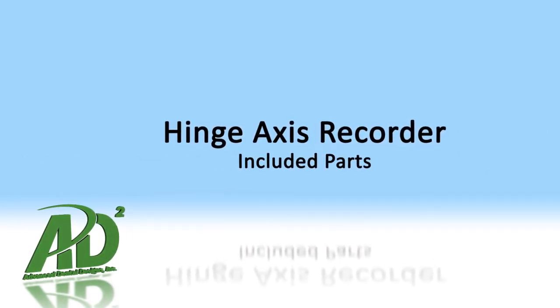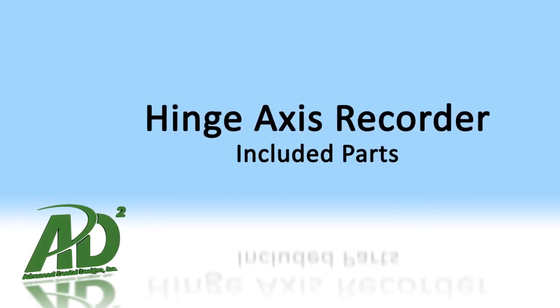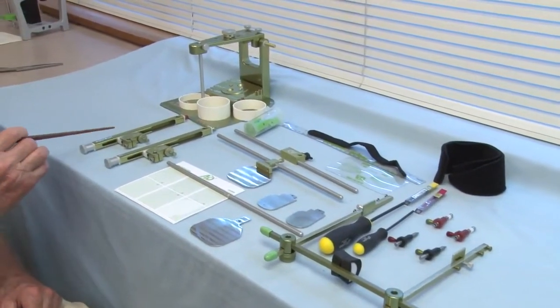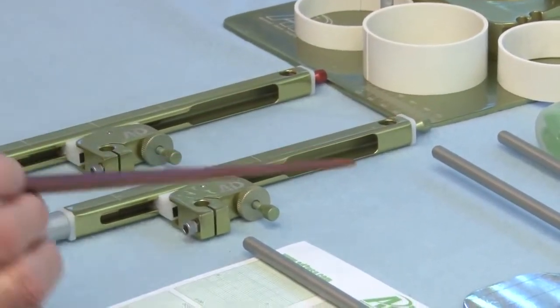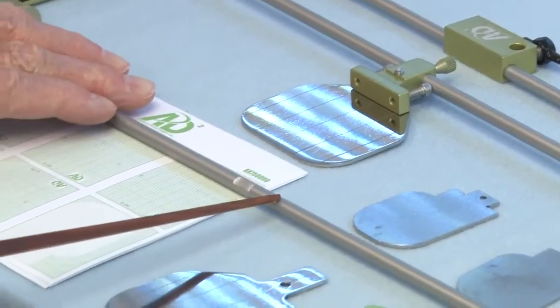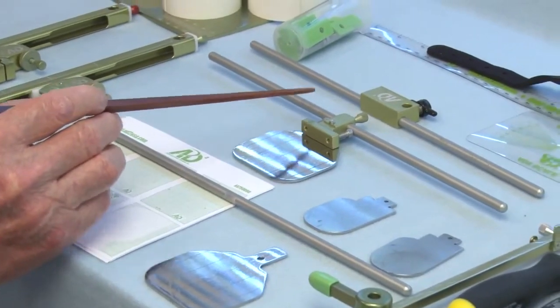I'd like to show you the parts of the instrumentation for the hinge axis recording system made by AD2. These are the side arms. There's a right and a left. This is the crossbar for the lower member. This is that crossbar.